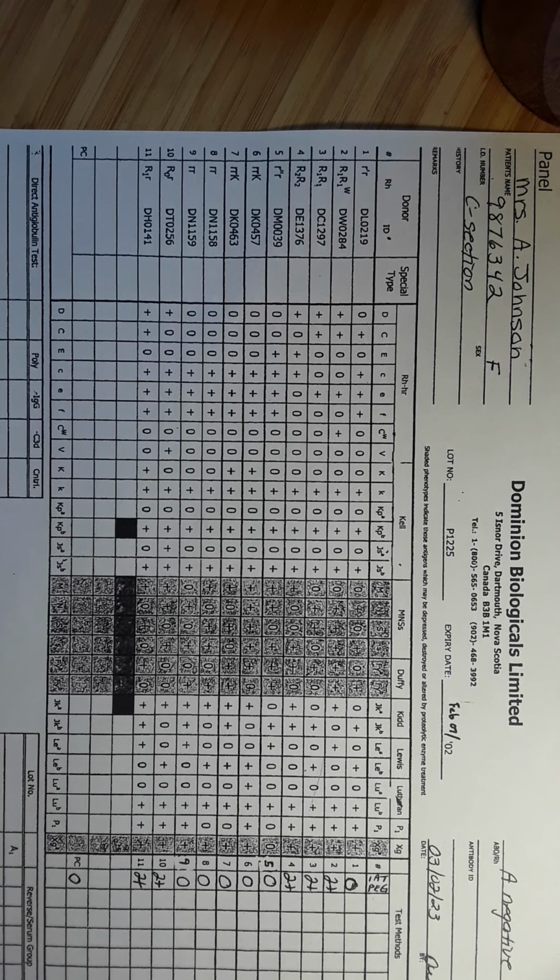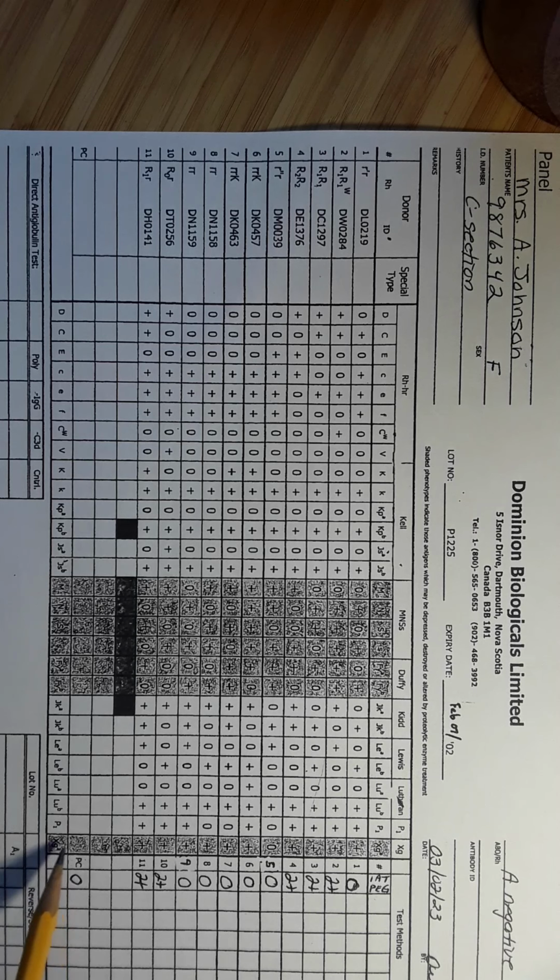So, according to page 9, step number 1, the first thing that we're going to do is check the auto control. Down here at the bottom, it says PC, which means patient cells. And we can see that the patient cells put in a test tube with their own plasma did not react. So that's the first thing that we check.